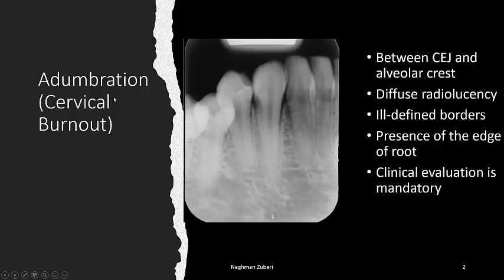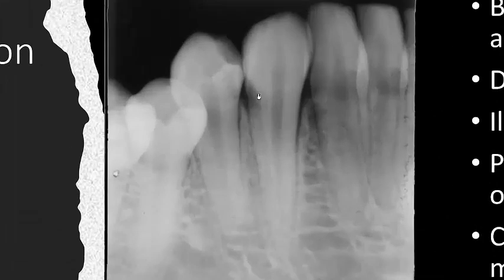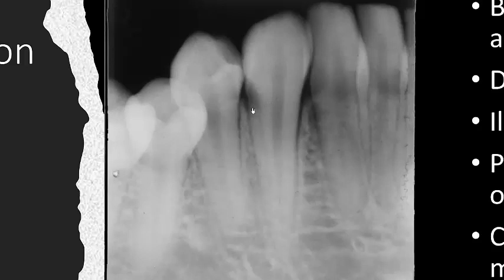This cervical burnout is present between the cementoenamel junction and the alveolar crest. It is a diffused radiolucency with some ill-defined borders and there is a presence of the edge of the root, which I am going to show you after enlarging. Though this area appears radiolucent, the continuity of the edge of root is always present. This is a very clear-cut diagnostic feature — we can say it is just a normal tooth where there is an artifact present, and that artifact is known as cervical burnout. There are no caries here.